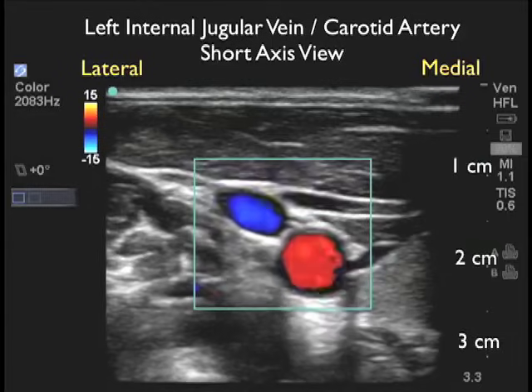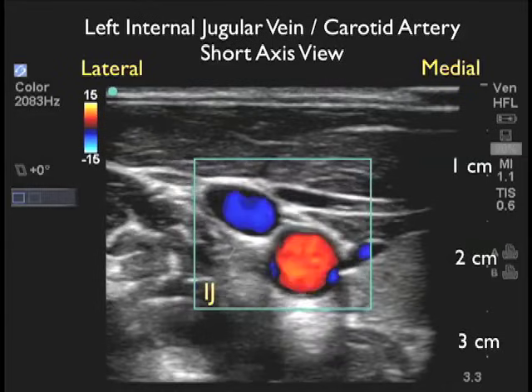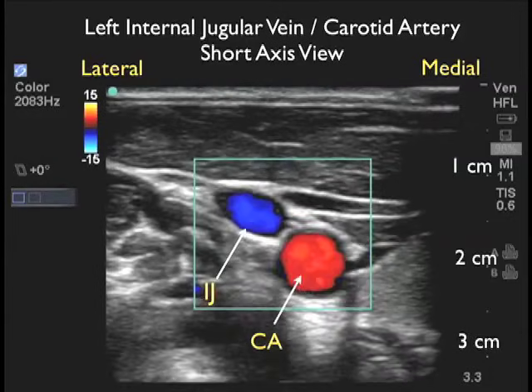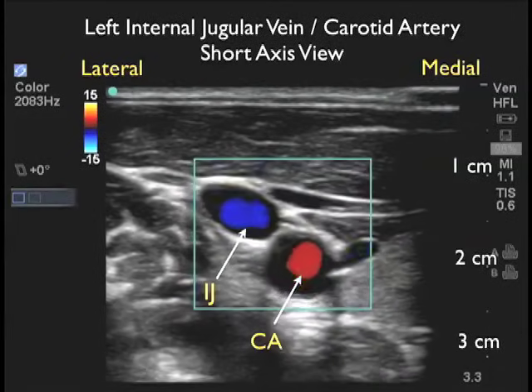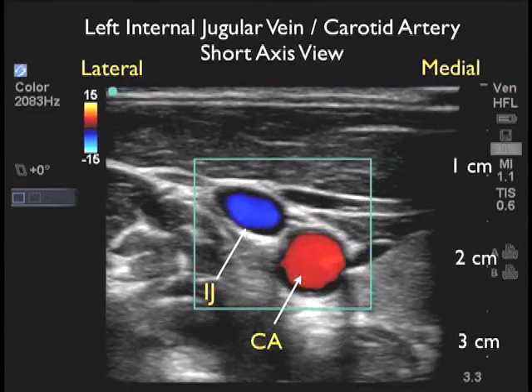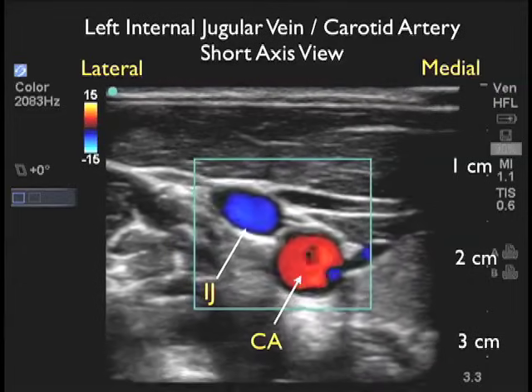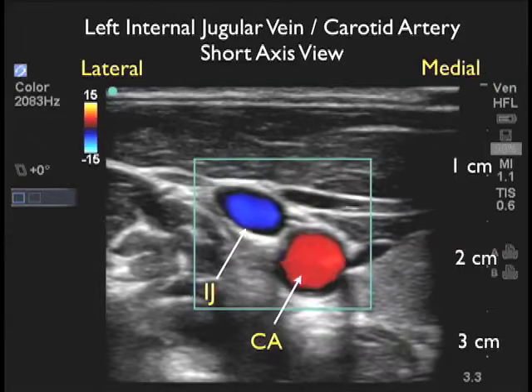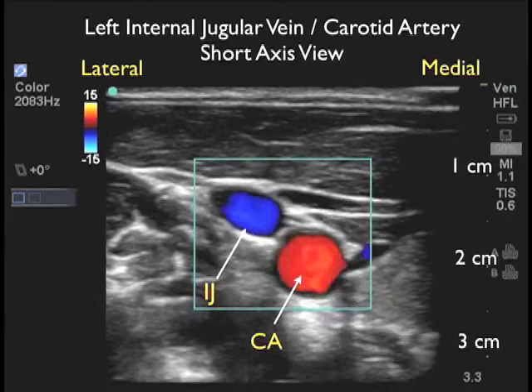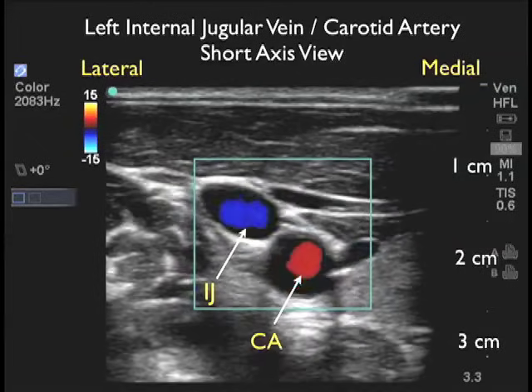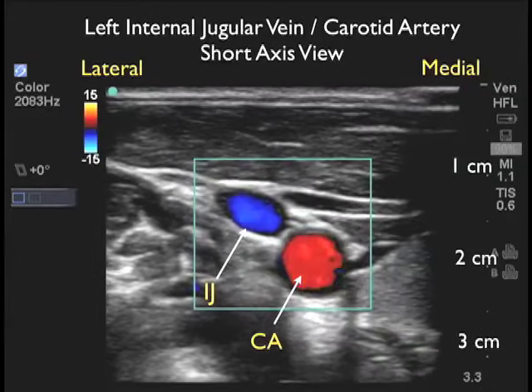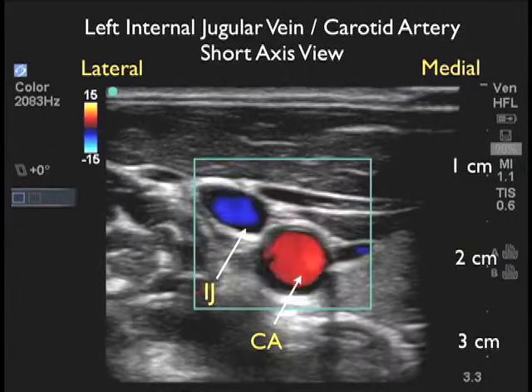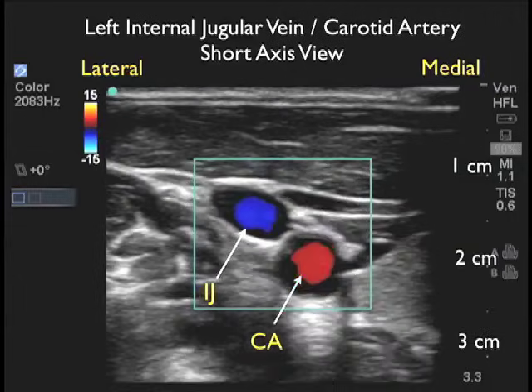Now we can apply Doppler sonography to further differentiate the two structures. We notice the internal jugular vein lying lateral and superficial to the carotid artery. The Doppler sonography shows steady pulsations of the internal jugular vein that vary with respiratory pattern, while the carotid artery shows pulsations with each heartbeat. We can also press down with the probe — the internal jugular vein should compress completely, while the more muscular outer walls of the carotid artery should keep it open.